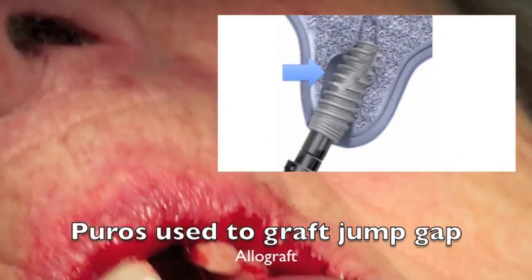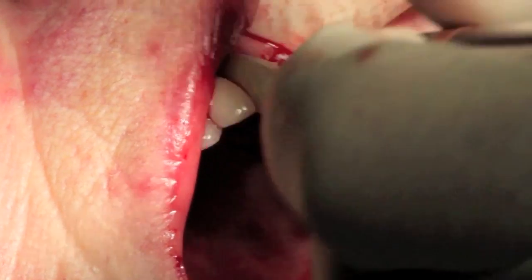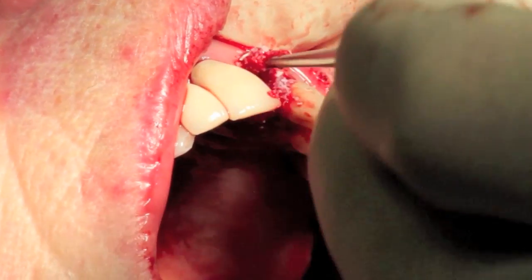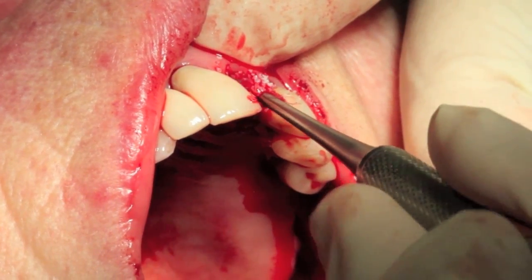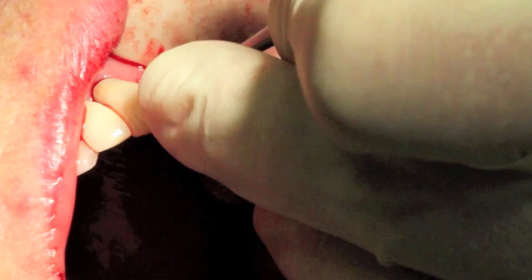So we're going to put some allograft up in this area so that we can help to preserve that buccal plate and keep that area more aesthetically pleasing. It's thought that by placing the bone graft in the jump gap, it prevents the shrinkage of the bone and keeps that area from being a little bit more apt to have some recession.